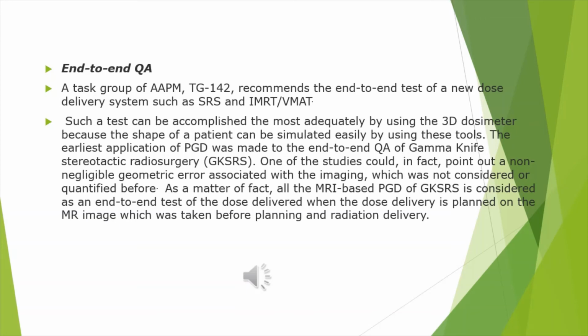stereotactic radiosurgery. One of these studies could in fact point out a non-negligible geometric error associated with the image, which was not considered or quantified before. As a matter of fact, all of the MRI-based PGD for GKSRS is considered as an end-to-end test of the dose delivered when the dose delivery is planned on the MRI, which was taken before planning and radiation delivery.